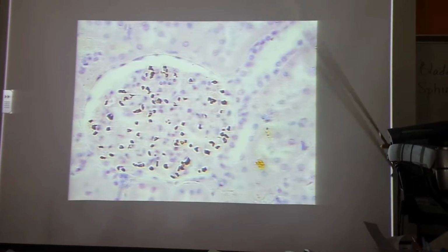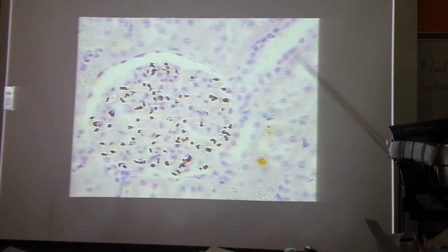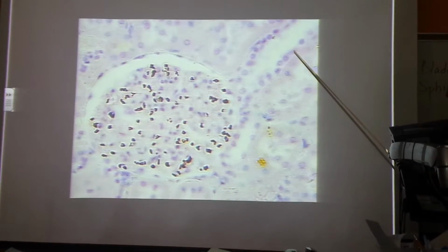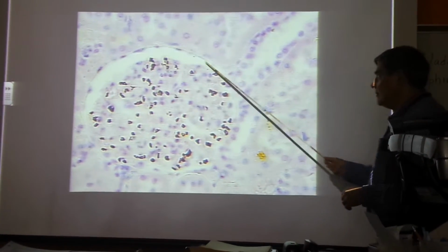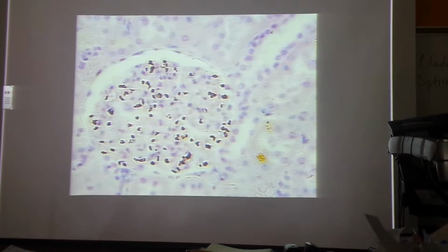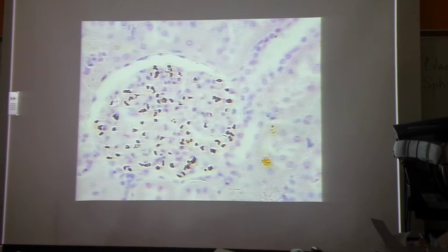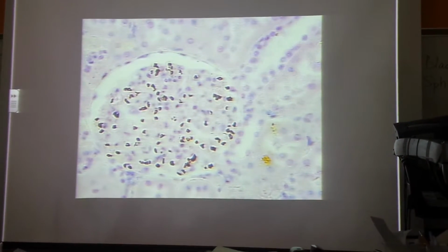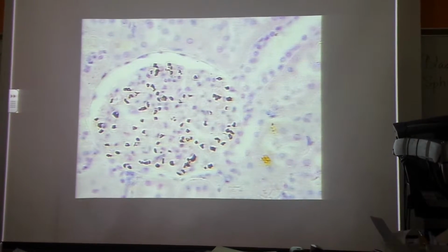Okay? So again, most of the renal tubule is simple cuboidal epithelium with these spherical nuclei. The exception again, the wall of the Bowman's capsule, the glomerular capsule, simple squamous. The thin segments of the loop of Henle, simple squamous, and then the cells of the macula densa in the distal convoluted tubule, simple columnar epithelium. Okay, and look at that on the models.